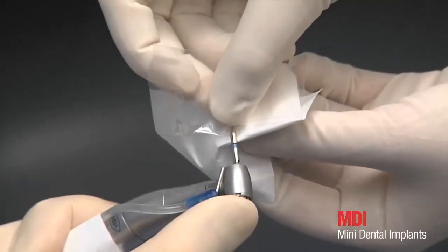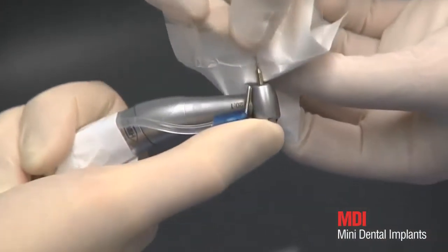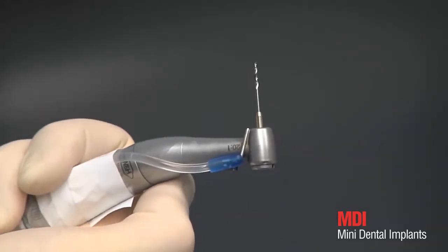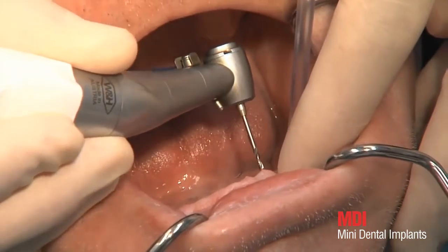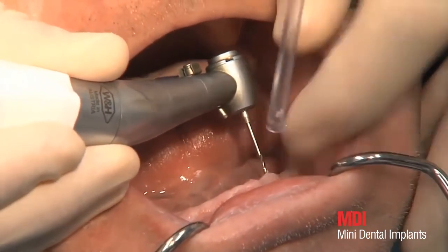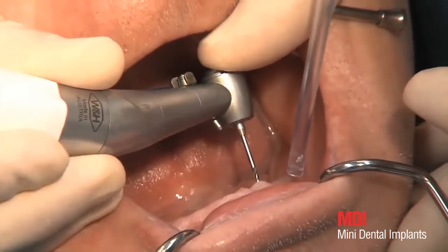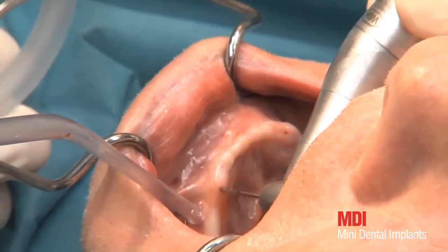It is a disposable drill for single use only. Drilling should be done with external cooling using sterile saline solution. To ensure safe guidance, the contra-angle handpiece should be supported on the power head. To prevent thermal damage to the bone bed, the drill must be moved up and down. This also enables more efficient cooling.